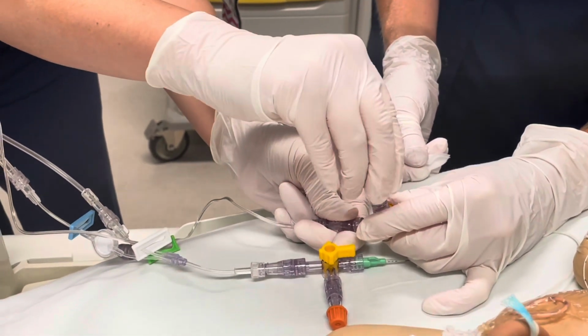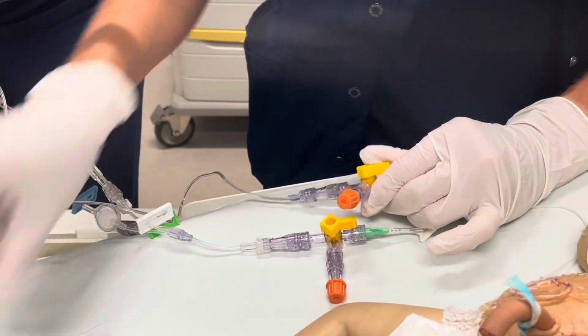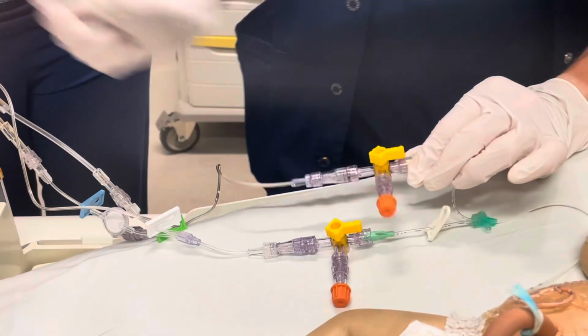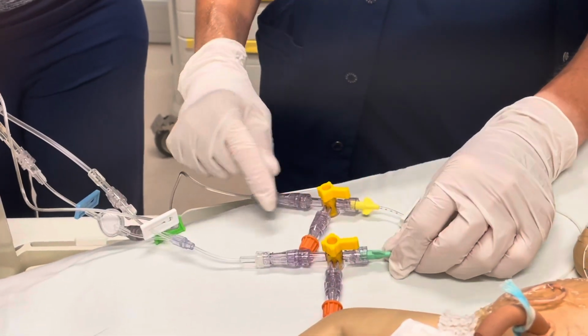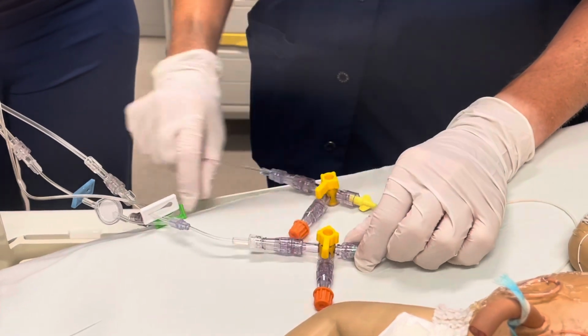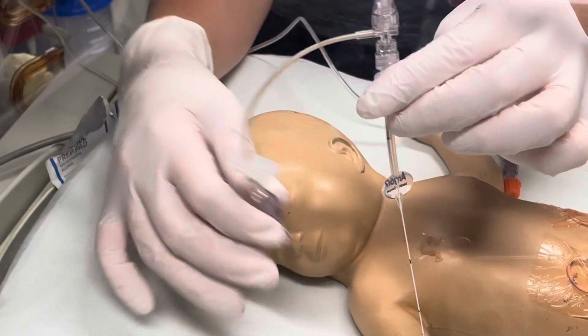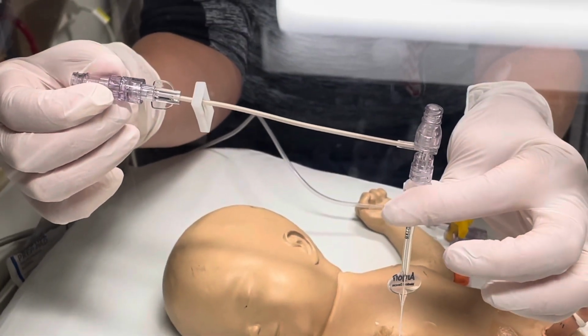Anytime you have a double lumen UVC, the primary lumen will be used for your maintenance fluid. The second lumen is typically used for IV medications or IV drips. Once your IV pumps are correctly running, everything is verified, you may turn on the IV fluid back to the baby. This is a demonstration of the PICC line.